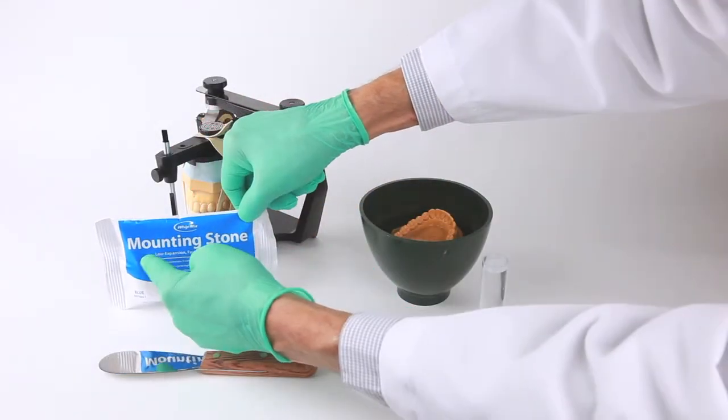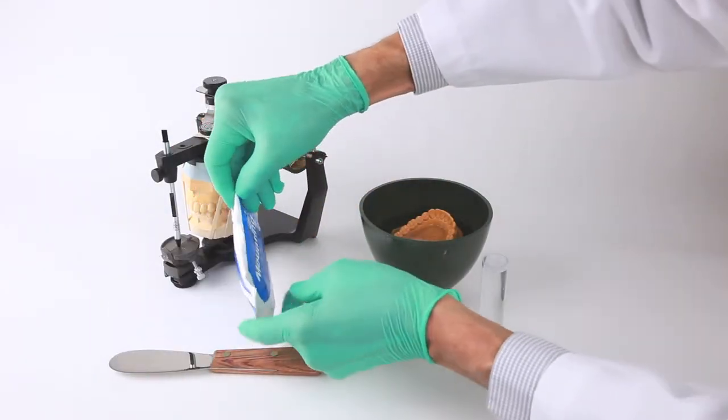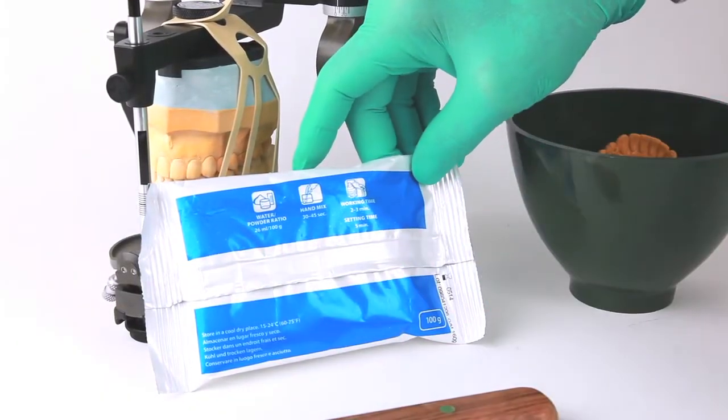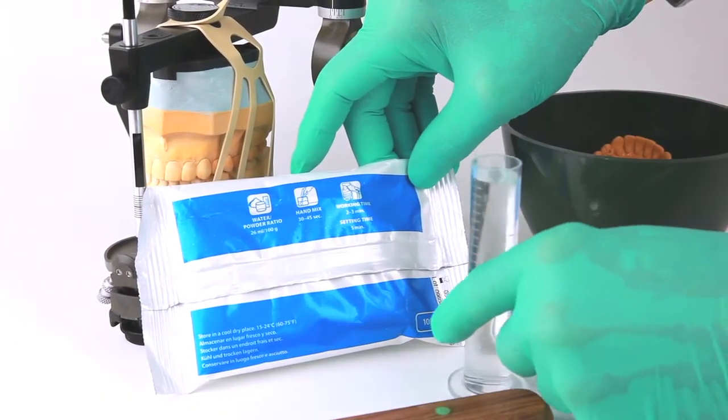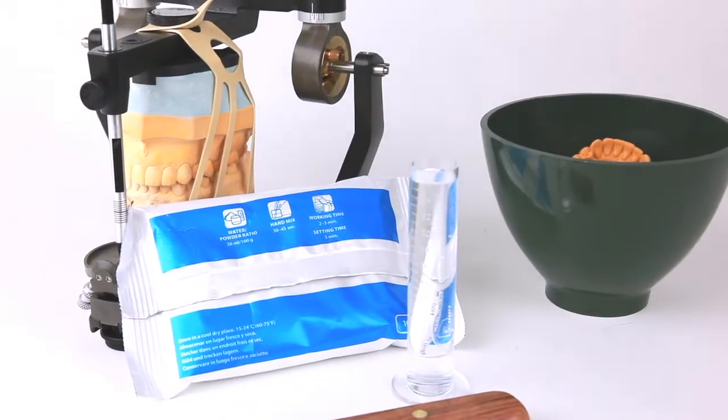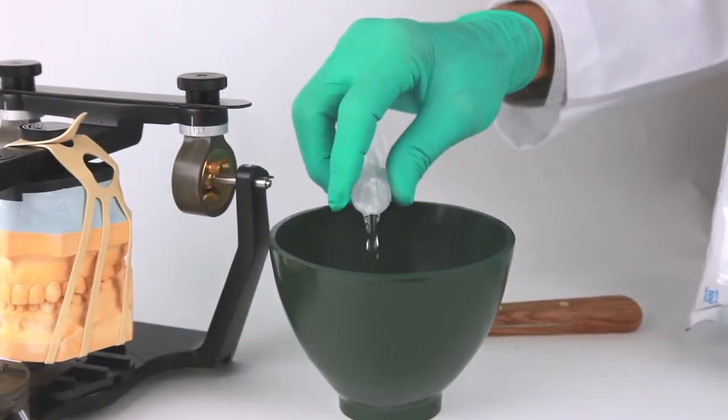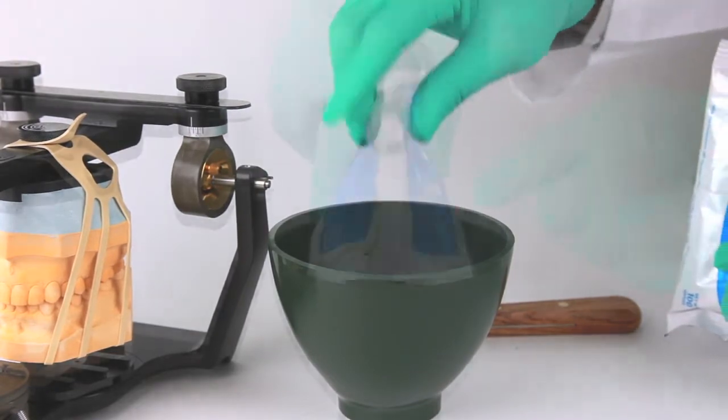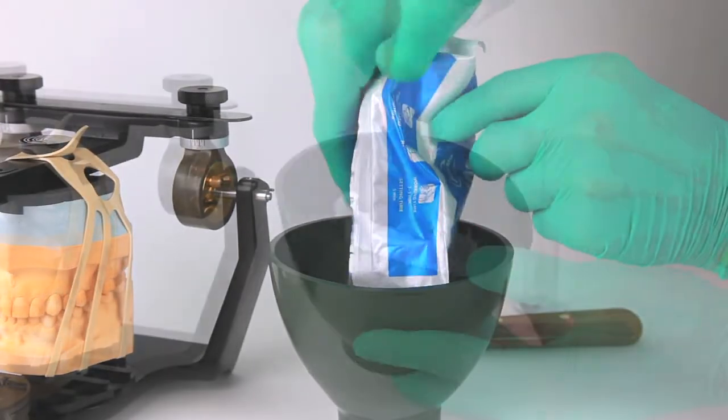At this time, we are now ready to mix the mounting stone or plaster, paying attention to the proper water powder proportions so that an ideal consistency and setting expansion can be obtained. This is accomplished by placing the water in the mixing bowl first and then adding powder to it, mixing to a smooth creamy consistency.